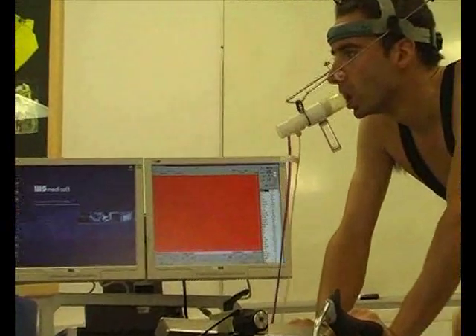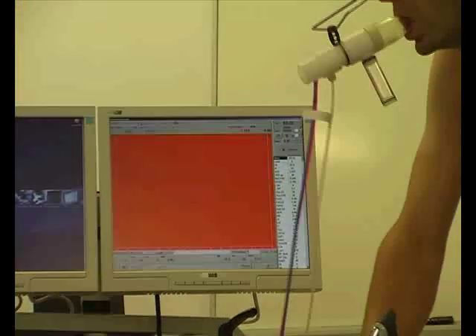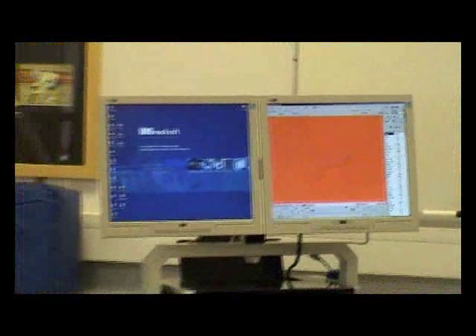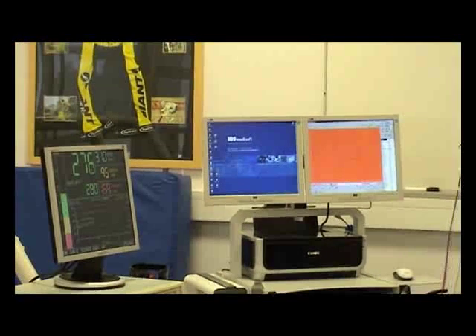Of course, we need to measure oxygen uptake. Here is the Medisoft screen showing the traces. The breath-by-breath system allows us to measure not only oxygen uptake, but carbon dioxide and ventilation too.